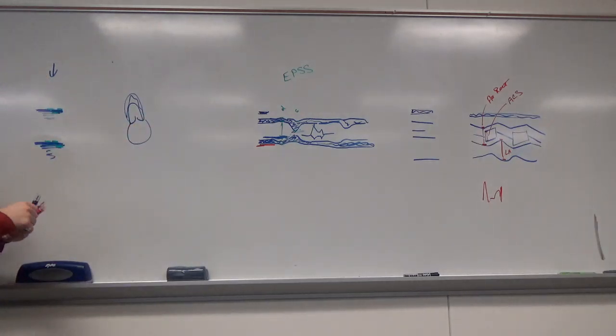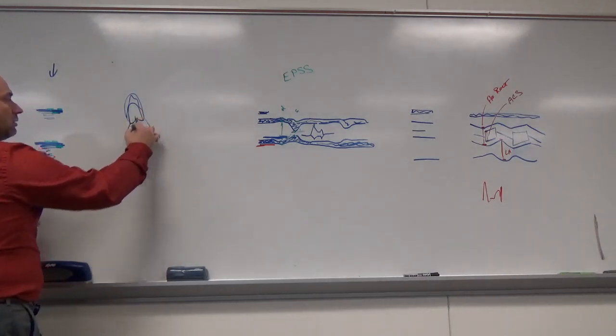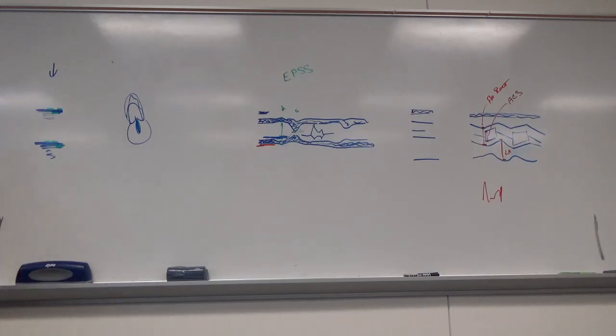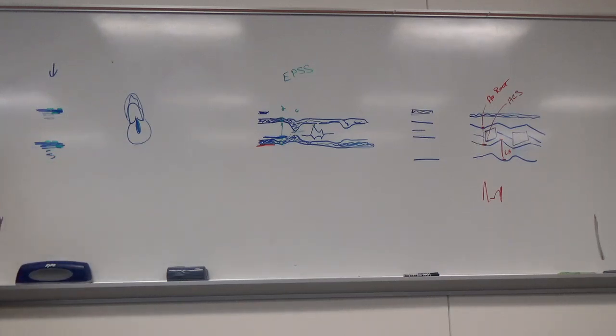So we're looking for regurgitations here. They would show up in blue because they're going away from the transducer. And honestly, if there's tricuspid stenosis, we'll take a look at it, but we don't care that much about it because it's not common. It's a lot more common in the mitral valve, but not so much here. But tricuspid valve regurgitation, everybody has.